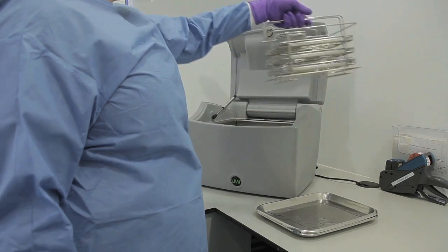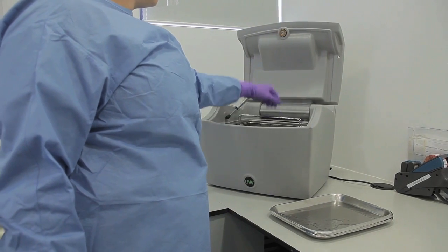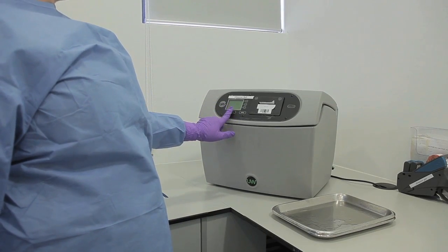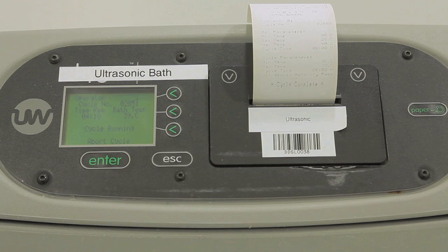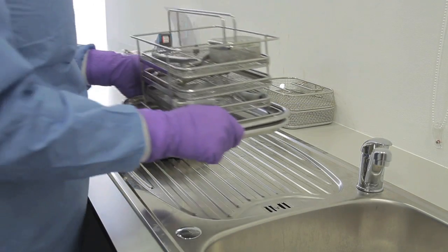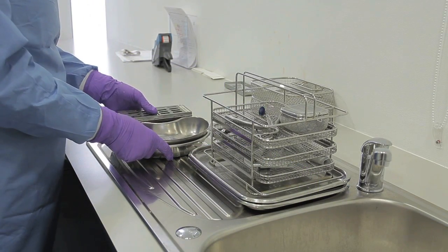This ultrasonic bath operates for a total of 6 minutes. The temperature range is a minimum of 20 degrees centigrade and reaches a maximum temperature of 40 degrees centigrade. These are the key parameters for checking the graph and releasing the instruments to the next step of the decontamination life cycle. This ultrasonic bath uses an enzymatic-based solution which helps to break down and loosen organic contaminants from RIMD.